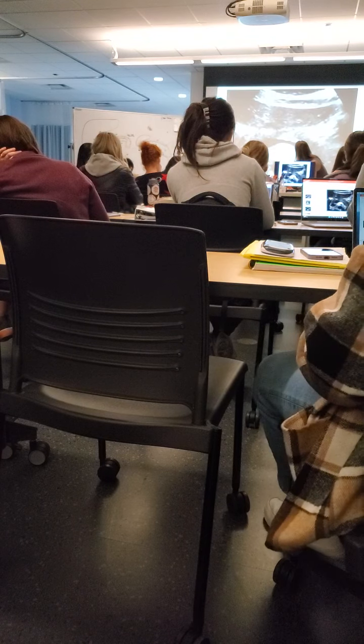And who's coming in this way? SMA. SMV. Ah, SMV, you got it. Okay, and then who's this guy? IVC. And we can't see him, but who's this imaginary thing going through here? Left renal. Right, who's this guy? SMA? Aorta.